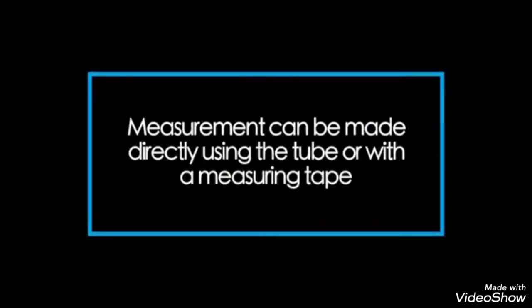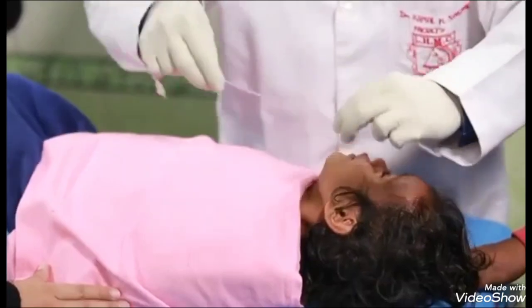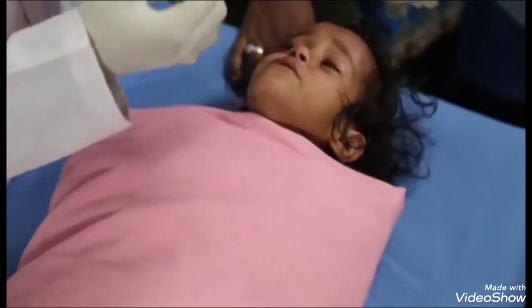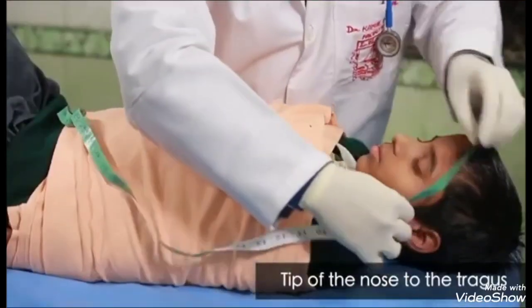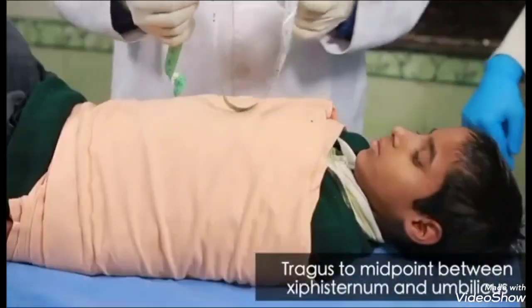One could make this measurement directly using the tube or else using a measuring tape. The Ryle's tube needs to be placed in the body of the stomach through the nose. The required length of the tube to be inserted can be ascertained by measuring the distance from tip of the nose to the tragus and then from tragus to the midpoint between xiphisternum and umbilicus.